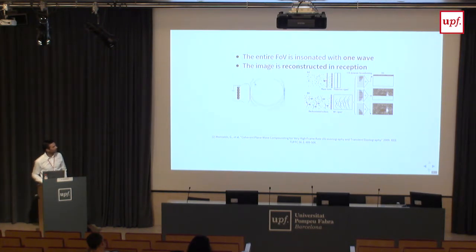And one way to achieve this is by sending a plane wave from the transducer, which you can achieve by setting the same delay in all elements, for example. And then this wave will propagate and will touch all the scatterers in your space, and then the wave will come back. If you do this, then you don't have to go line by line. You can do just one line for everything. So as you see, it can be simpler. So if it's simpler, why weren't we doing this before? Well, you need to come up with a way to define your lateral resolution to start with. But also, if you have to keep up with the frame rate and reconstruct your image in real time, you need very, very high computational power. And this wasn't available to us until recently with the advent of GPUs and so on.